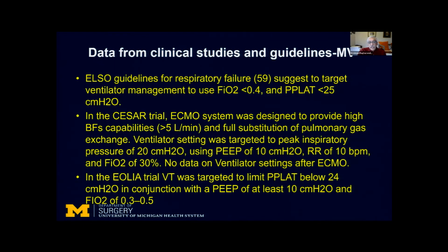However, in the EOLIA study, tidal volume was targeted to keep the P-plat below 24 in conjunction with PEEP of at least 10 and an FiO2 of 0.3 to 0.5. Makes me think that the ELSO guidelines were directly transposed based on what we found in the EOLIA study. So this is an important thing to remember: we are targeting plateau pressures below 24, with PEEP of at least 10 and FiO2 as low as possible.